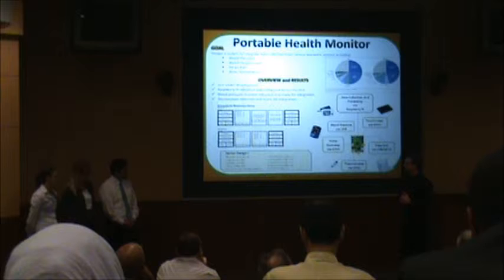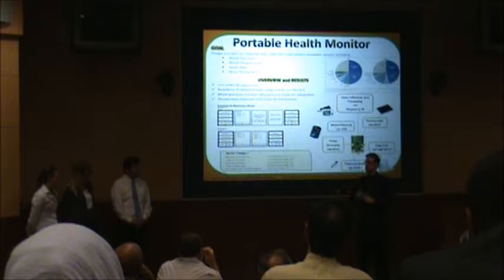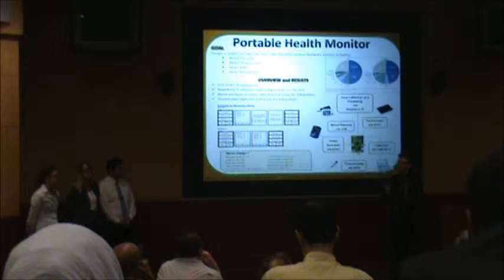We're developing a pulse oximeter. We're using an analog front-end IC from TI, the AFE4490, that's made specifically for pulse oximetry. The temperature sensor, we haven't decided on the exact sensor we're going to use, but we're hoping that's going to be the simplest one to implement. And the heart rate is actually part of the non-invasive blood pressure and pulse oximetry measurements, so that's inherently going to be part of that measurement.